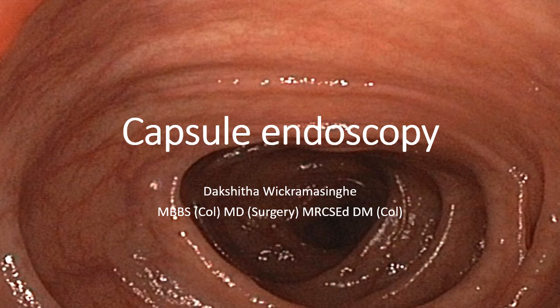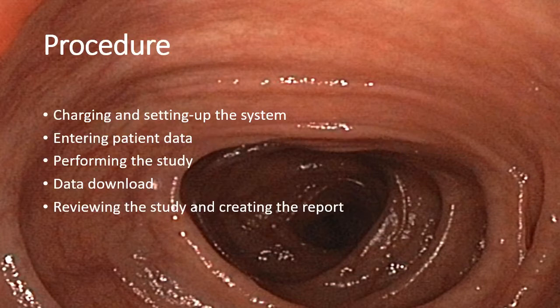This is a step-by-step guide to performing capsule endoscopy. Performing a capsule endoscopy includes the following steps: charging and setting up the system, entering the patient data, performing the study, data download, and reviewing the study and creating the report.